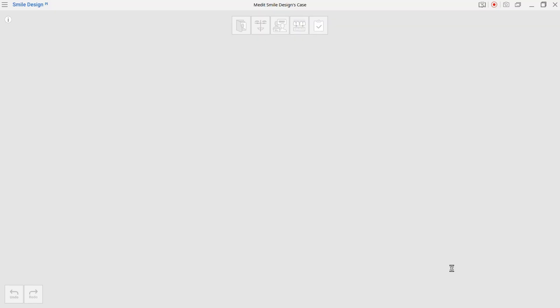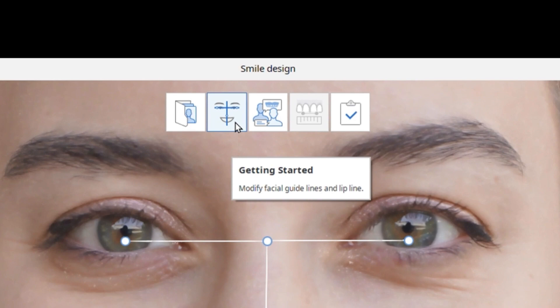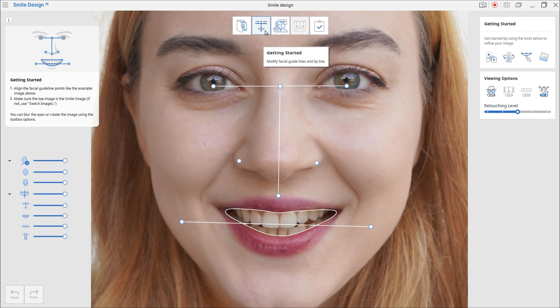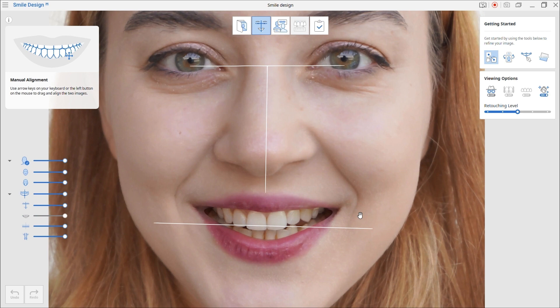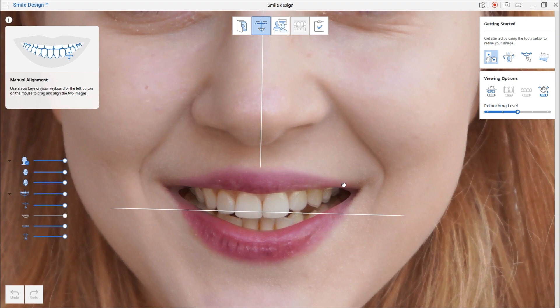Begin the Smile Design process in the Getting Started stage. The two 2D images are aligned based on the position of the teeth, and the facial guidelines are defined. The program automatically defines the guidelines, but you can use the tools on the left to make any necessary changes. The first tool is Manual Alignment. If the teeth are looking blurry, use this to align the two photos together, based on the images' shared anterior regions.